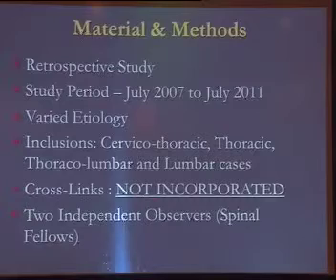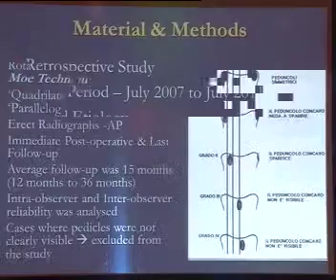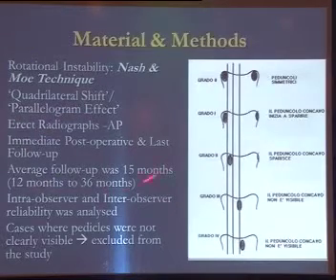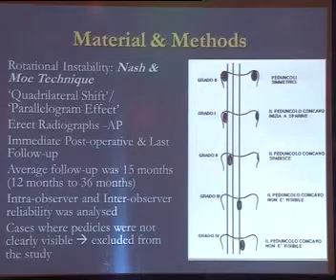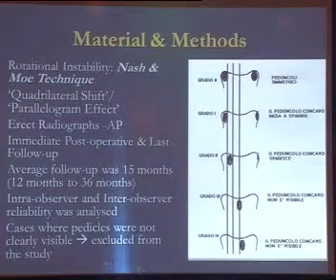Two of my spinal fellows, who were not involved in the initial work, did the study. What we studied here was the immediate post-op AP and the AP X-ray at the last follow-up. We checked for two things. One is rotational instability. Now, Nash and Moe technique is a very well established and validated way of analyzing rotation of the pedicle. The other thing we looked for was if there was any quadrilateral shift, that is called the parallelogram effect, in any of the patients in the follow-up.